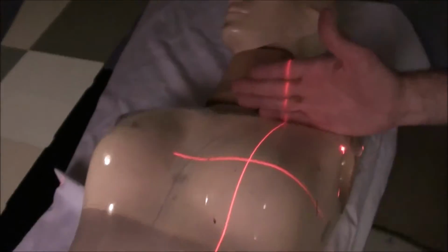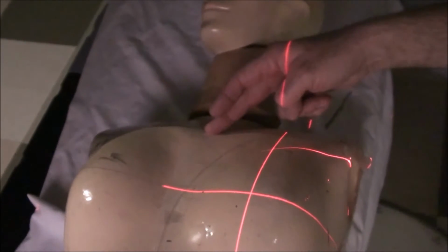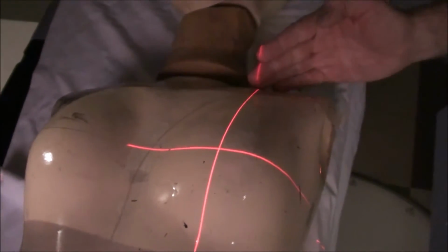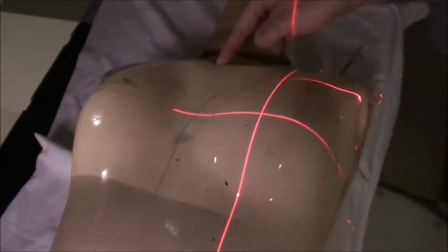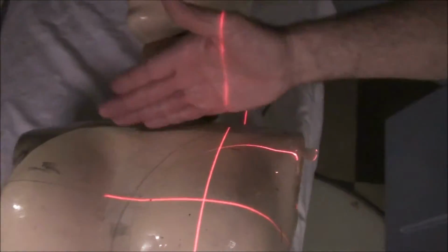Superiorly, you're going to go to the, I've suddenly blanked on the name of the joint, the sternoclavicular joint. Basically, if you aim for the SSN and then have your flash along there, you can even see the divergence going along here. You see the divergence in both axes.